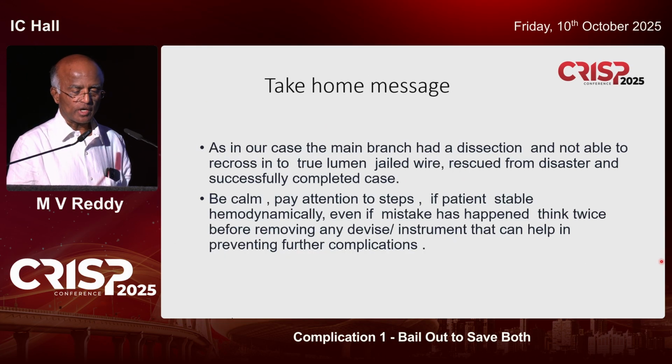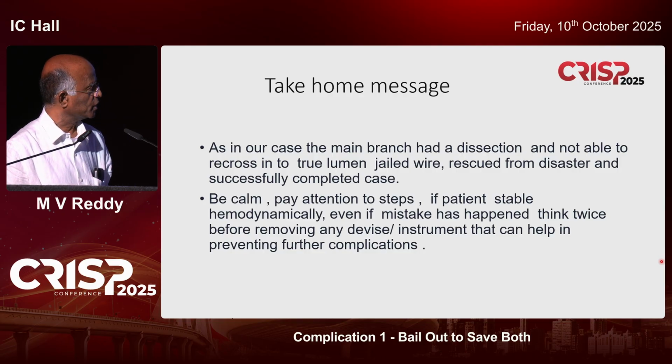I think this is my take home message: be calm, pay attention to your steps. If the patient is stable hemodynamically, even if mistakes happened, think twice before removing any device from the arteries or instrument which can help to prevent the complication.